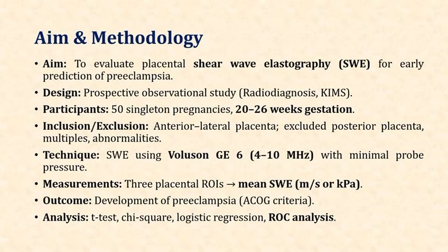The participants included 50 singleton pregnancies in 20 to 26 weeks of gestation. We included those with anterior or anterolateral placenta and we excluded those with posterior placenta or multiple gestation. The technique involved using SWE, using Voluson GE6, using 4 to 10 MHz frequency probe and minimal probe pressure.